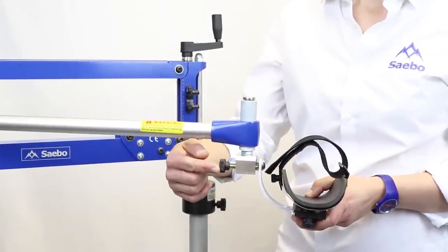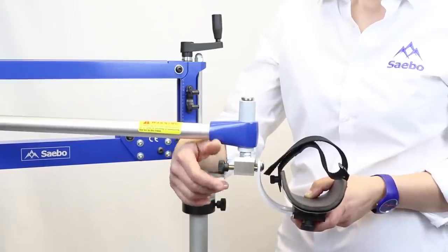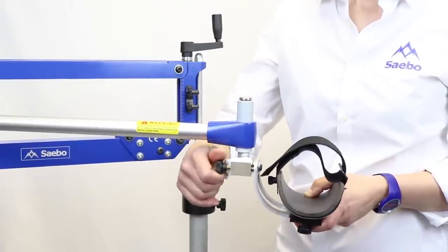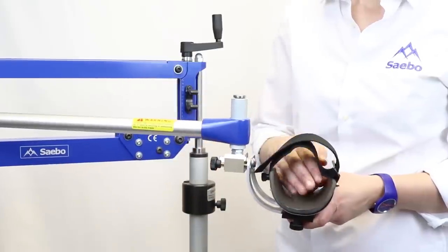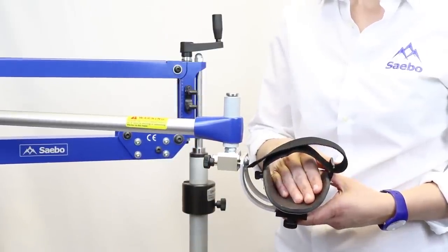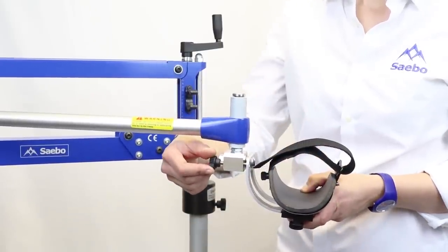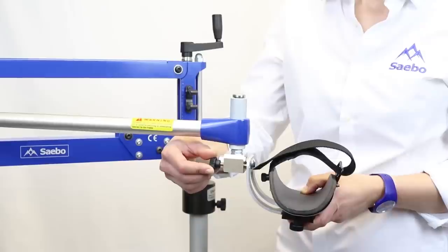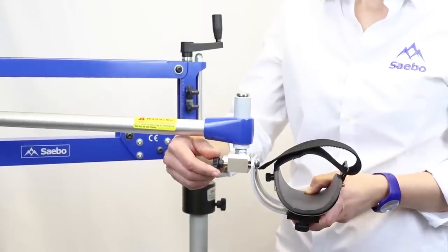This will then concentrate movement proximally around their shoulder. As they improve you can undo this to allow them more movement.